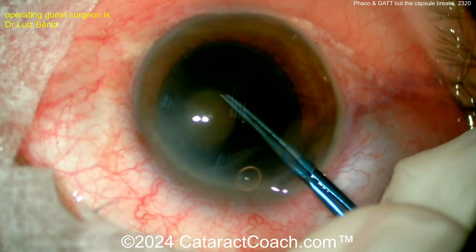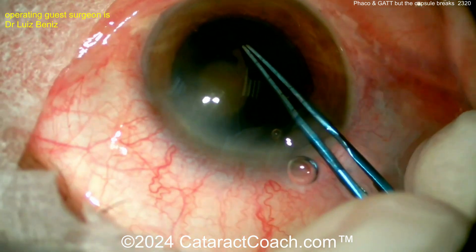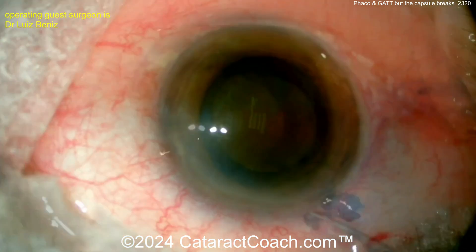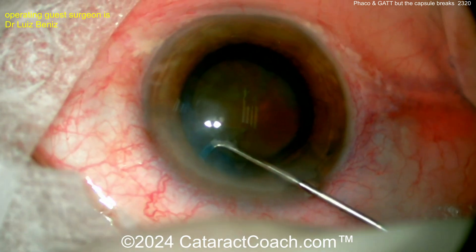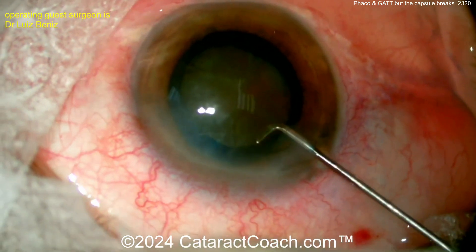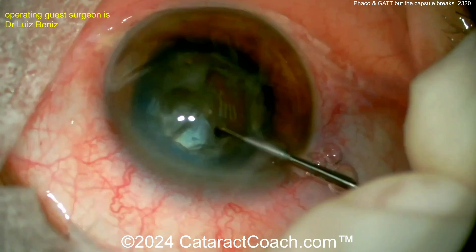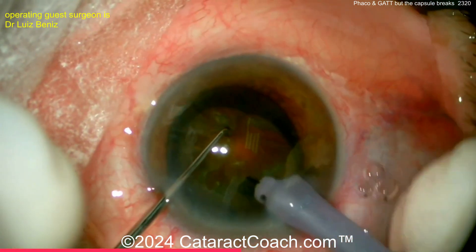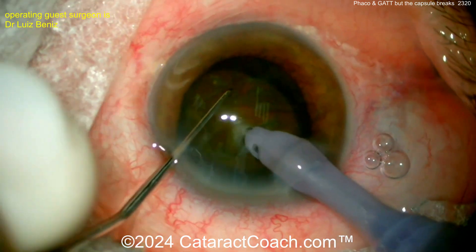Let's get back to doing the cataract surgery. Starting off with the capsulorrhexis — if I have a patient who needs a combined cataract and glaucoma procedure, the one thing I'm cognizant of is I want that IOL to stay really in that capsule bag. In some surgeries which are more invasive, such as a tube, an Ahmed valve, or a trabeculectomy, you may have post-op hypotony. In that case, I don't want the IOL to come out of the capsule bag. So you want to do a little bit smaller of a rhexis, maybe four and a half to five millimeters. Not much of an issue with MIGS surgeries because you're not going to typically get overfiltration.